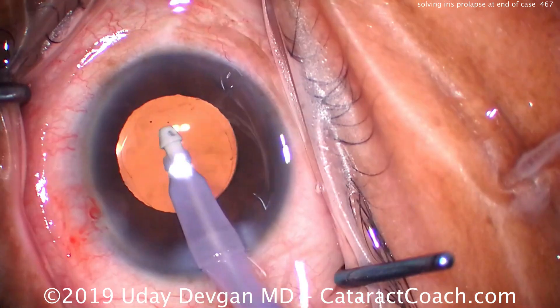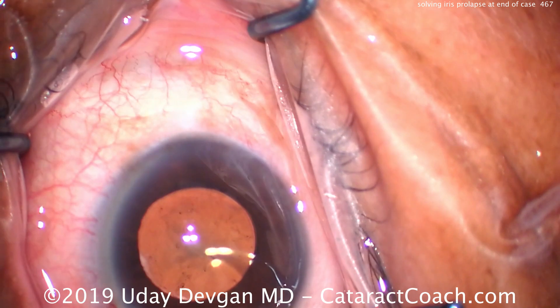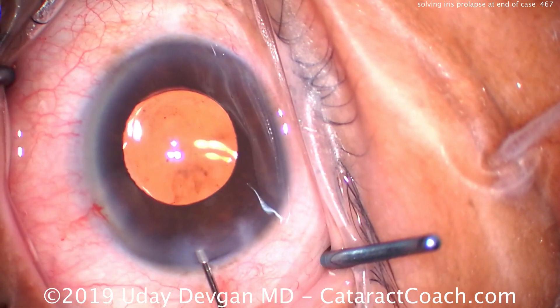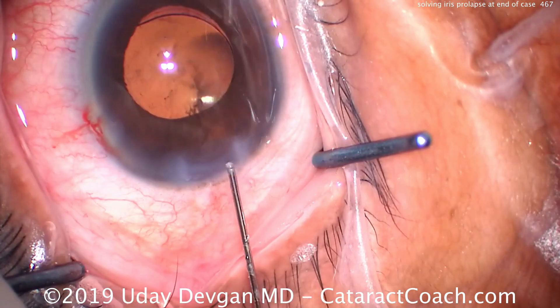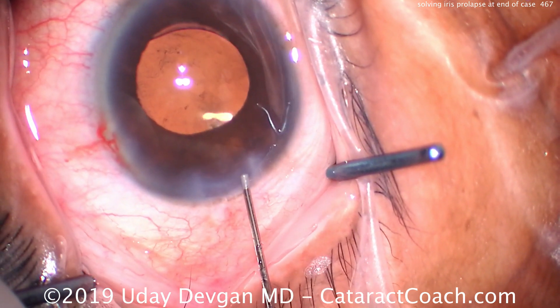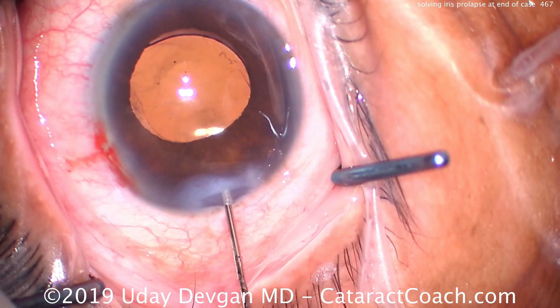For whatever reason — despite having a good incision and no Flomax on board — this patient just has low iris tone and some prolapse. We need to finish the case without entrapment of iris in the incision. There's a nice positioning of the lens, good overlap by the rhexis, and a little bit of iris prolapse coming to the incision. Let's hydrate and push the iris back, flatten the AC, and get the AC pressure to zero.